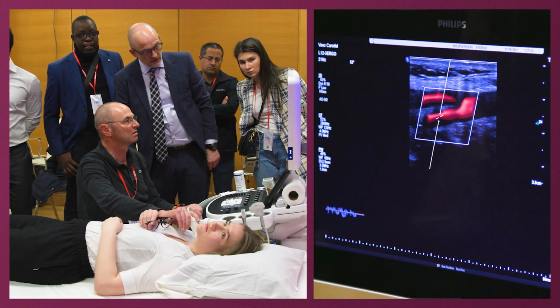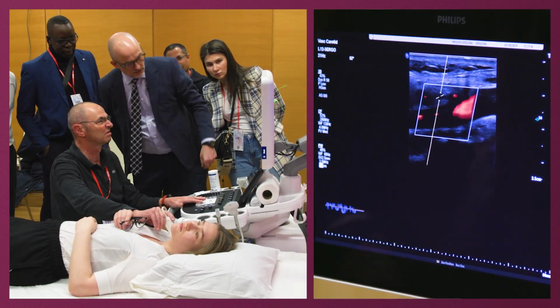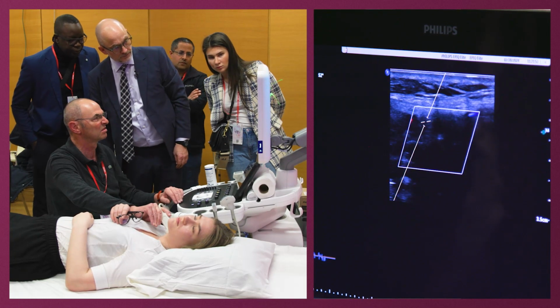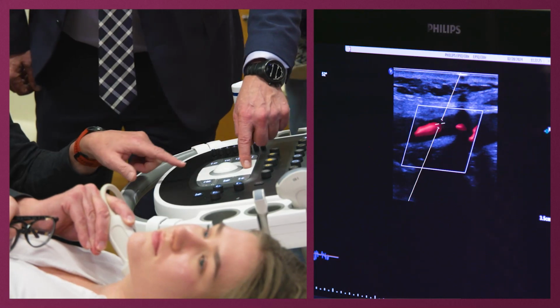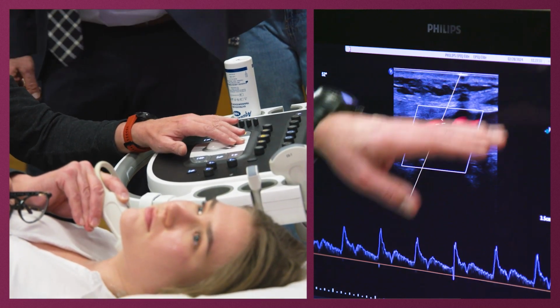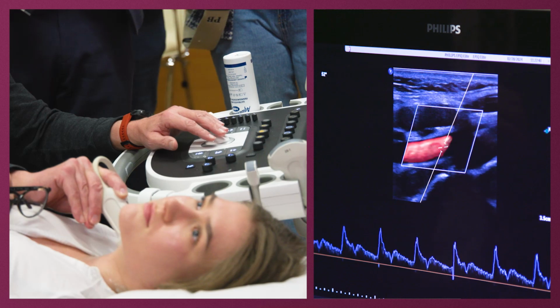Okay. Very nice. You see, it is seldom you see everything in one image. See if you can find a side branch somewhere, then we're happy, and then you have to have it in the center stream, this cross. You can push. I always use this shortcut up here. Okay. Agree. External. Yes, and here, put your auto measurements on external. So I would save it and write ECA forward. Exactly. This is the important one.